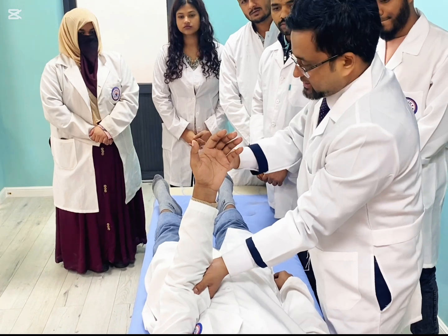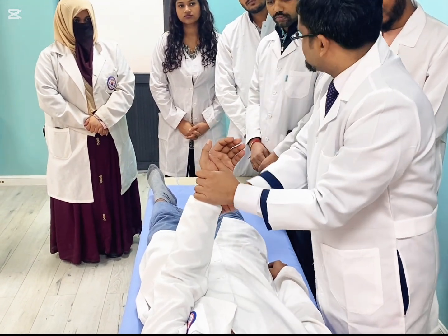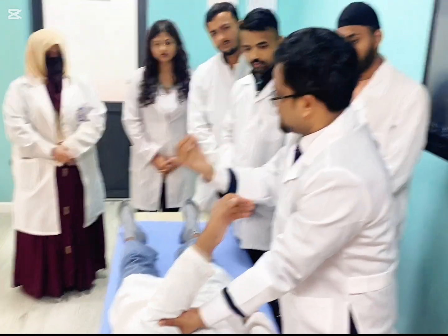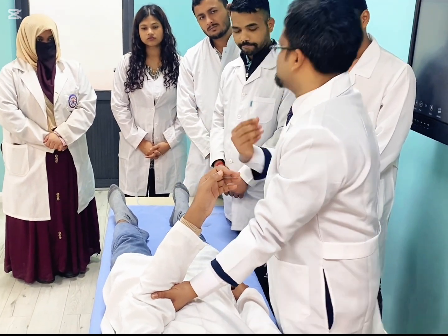You understand? Then you will release your hand, and use the stethoscope the normal way. You will release the cuff and try to hear the beat. When it starts beating, this is systolic. When it disappears, this is diastolic.